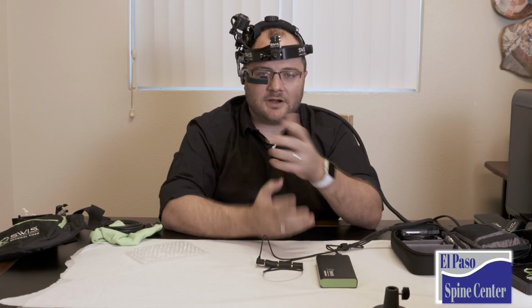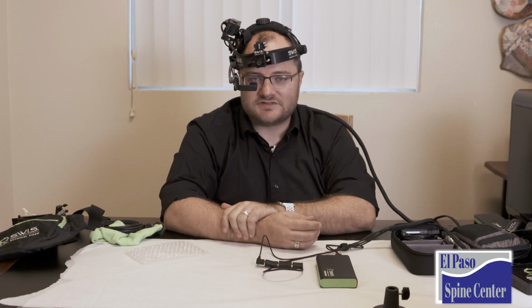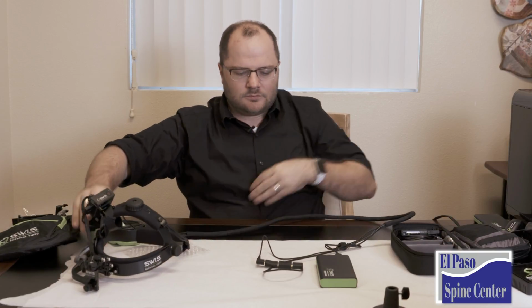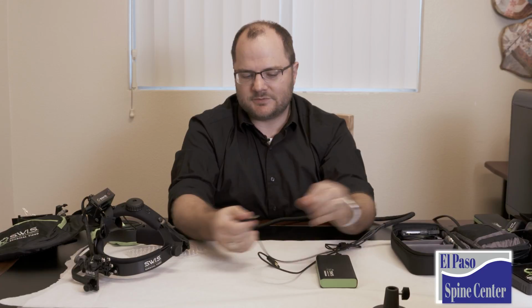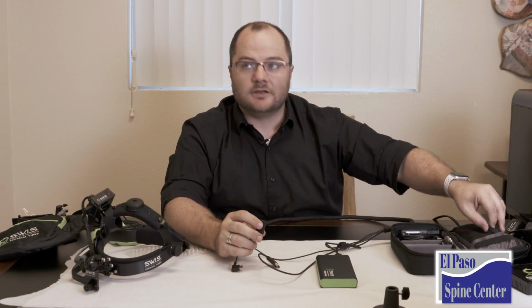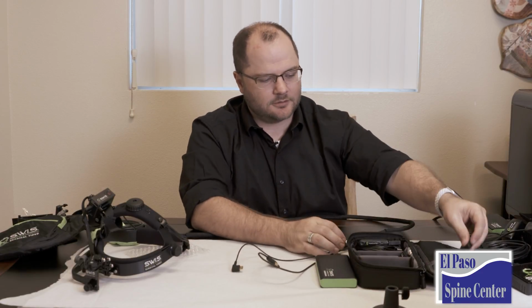But part of the power of this system is being able to record wirelessly to our wireless system that we set up earlier. So we need to pull out a few more pieces of equipment so we can do that. I'm going to unplug our adapter system here, although we're going to come back to this in a second. And I'm going to put these back in my case so that I know where they are.